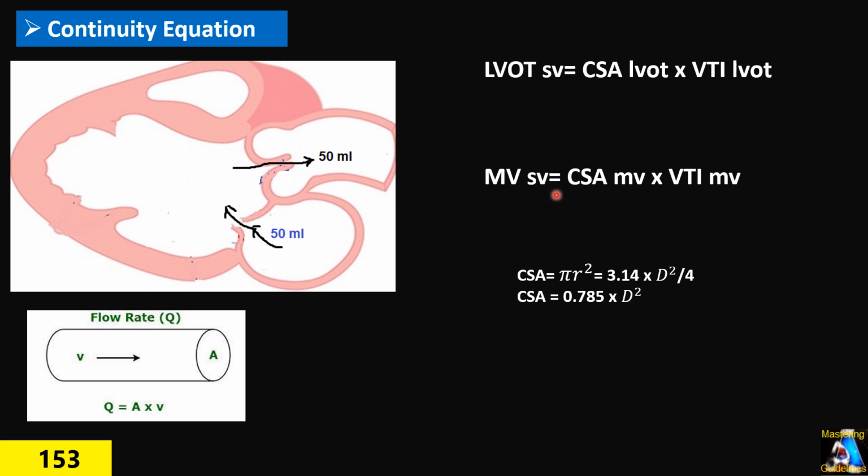For cross-section area, the formula for any cylindric passage or orifice is π times radius squared. Instead of π we can put the number 3.14. Instead of the radius we can practically use the diameter, because measuring the radius is hard in a cylinder, finding the center of the circular area. So we measure the diameter easily, and if we calculate this, finally cross-section area can be measured by 0.785 multiplied by diameter squared. In that case, it is very easy. We can put this formula in place of the cross-section area, then we just measure the diameter and we have the cross-section area of that spot.